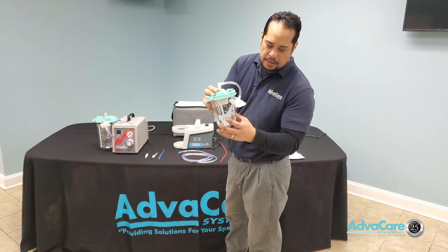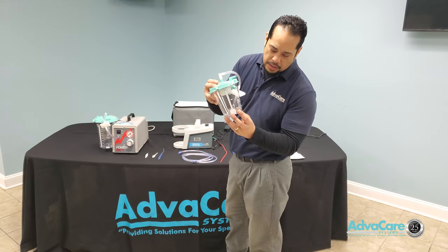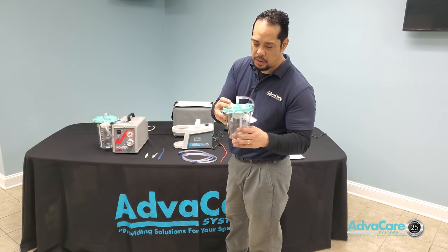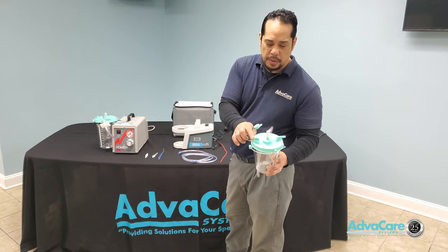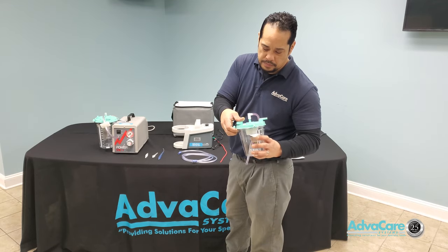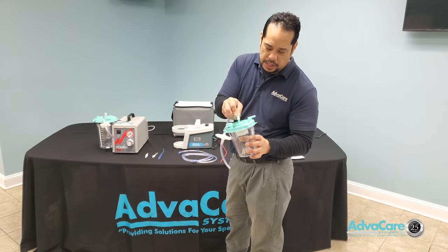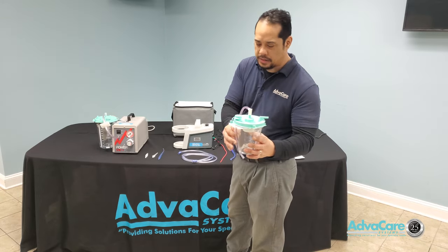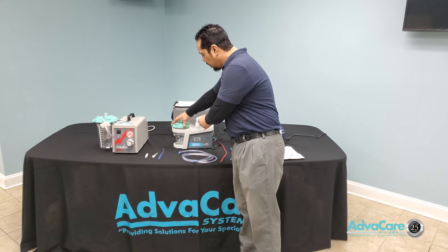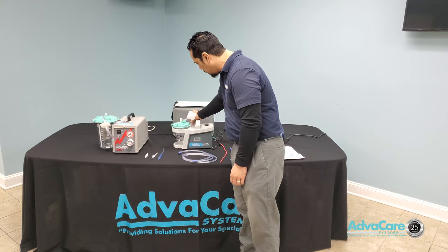The same rules apply: make sure there are no cracks or air leaks within the canister that would cause suction pressure not to build properly. Any open spaces on the canister lid should be kept capped off. The hydrophobic filter with your suction elbow and tubing will connect to the center point of the canister.